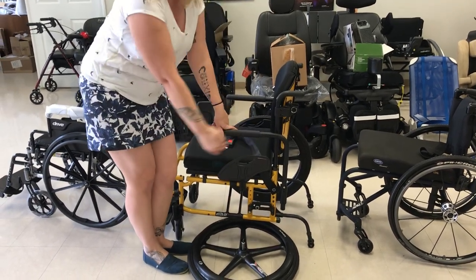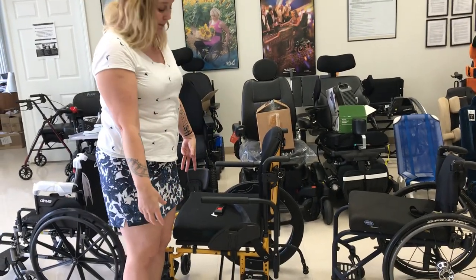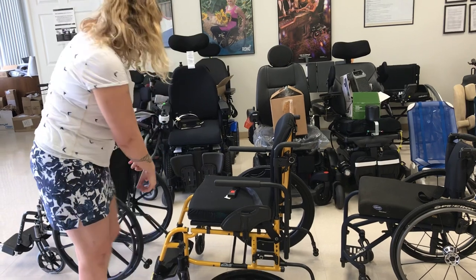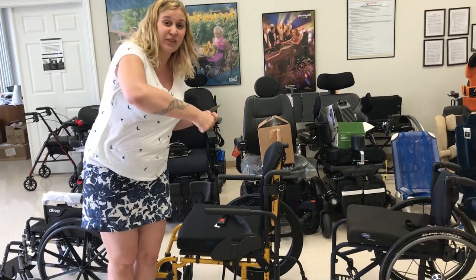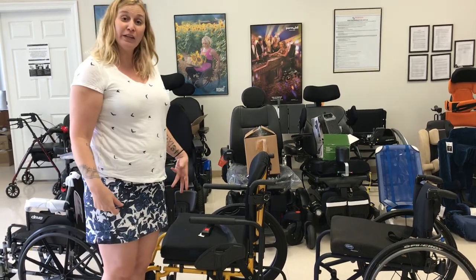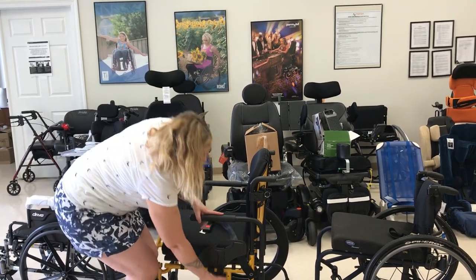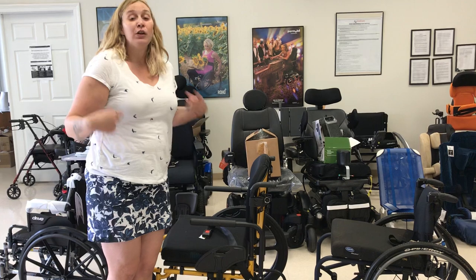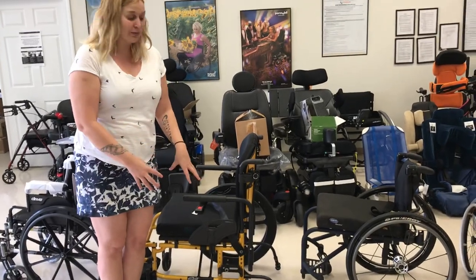We can move the wheel forwards and backwards to make sure that people have a really good push, so we can look at their biomechanics of how they push. We can also balance their weight and their center of gravity, so we don't want all of their weight on the front casters. If you've ever been with someone who uses a wheelchair on grass and those front casters are digging in, we want to really balance that weight — it's also important for people to be able to do a wheelie to avoid hazards. We can also move this plate up and down to help gain access to the wheels, which helps look at their biomechanics and their access to actually pushing the chair. So that's the biggest thing — that adjustable axle plate.